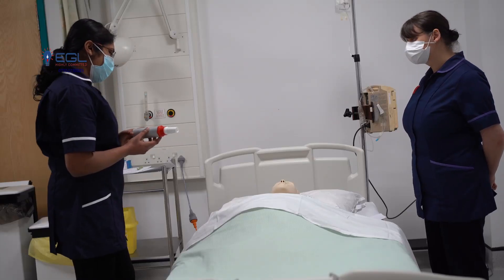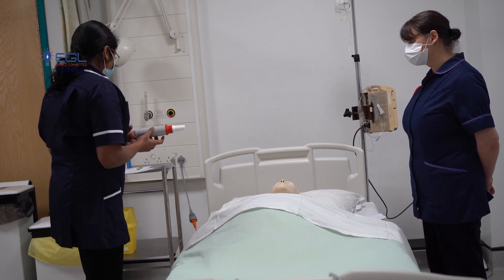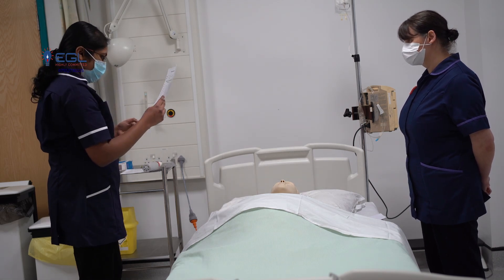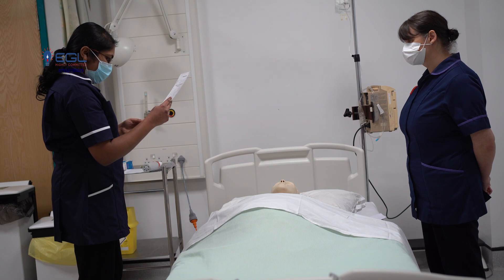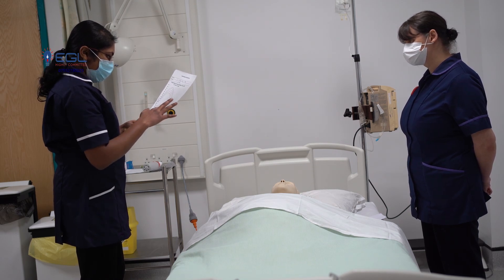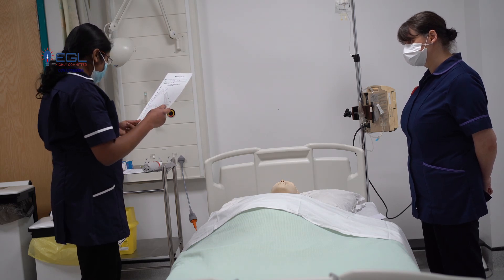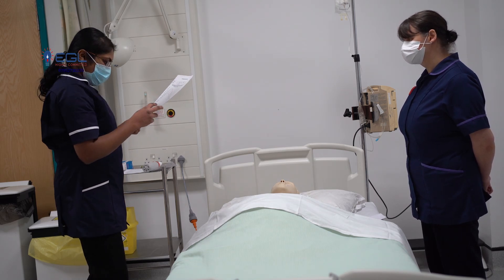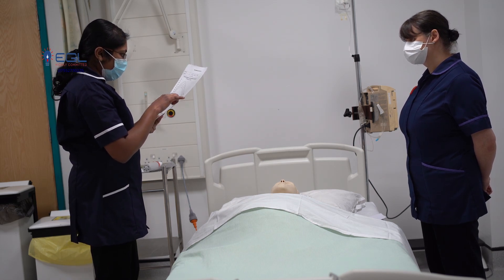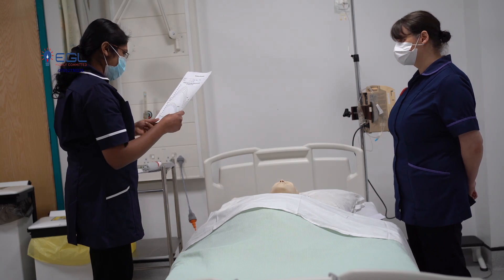Before proceeding further, I would like to know your expected peak flow using your chart. According to this chart, your age is 70, your gender is male, and your height is 160cm. The expected peak flow rate is 490 litres per minute.